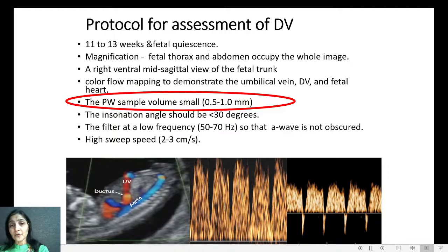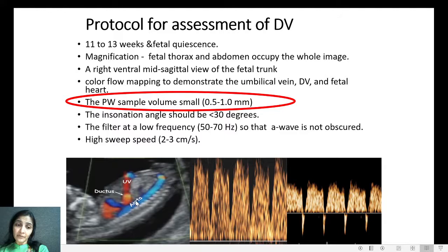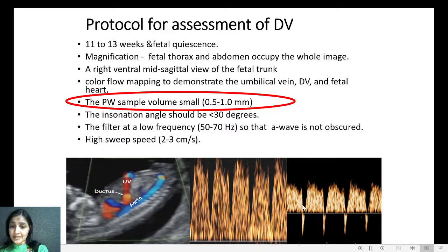Coming to the protocol for assessment of ductus venosus: magnification should show only the thorax and abdomen of the fetus. We should be able to see the umbilical vein, aorta, and the ductus venosus. The sample volume should be small and the speed should be high. Normally we see a triphasic waveform without any flow below the baseline. When we see flow below the baseline between two waveforms, this is called A-wave reversal and it is a marker for aneuploidy.